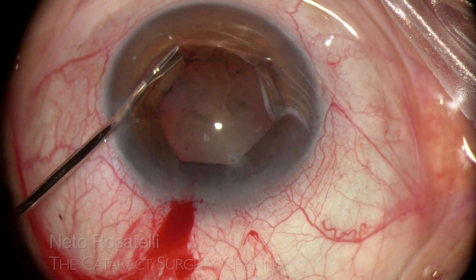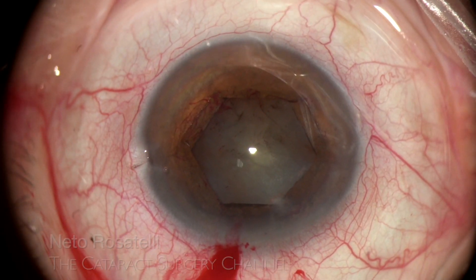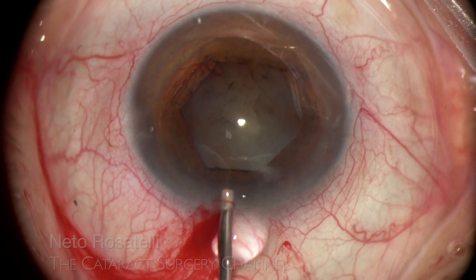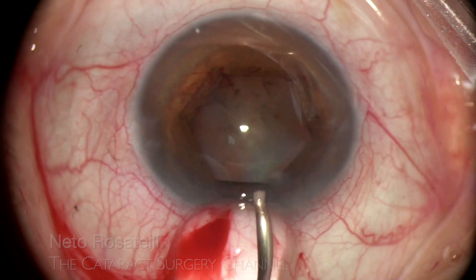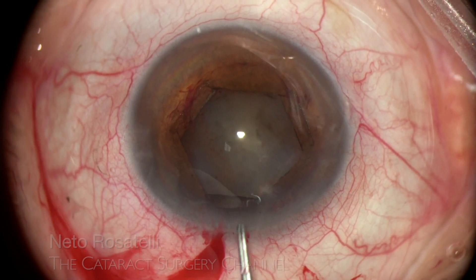A little repositioning, and now we're talking — what a difference! A very challenging situation was overcome, and a much easier and safer surgery can be performed. Anterior chamber OVD refilling is done again, situational assessment returns a green light, and we're go!